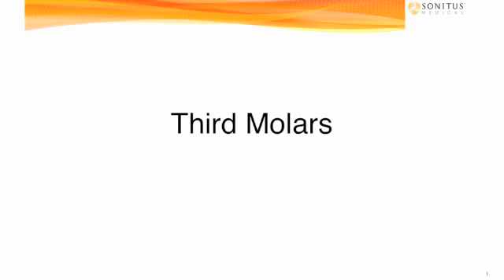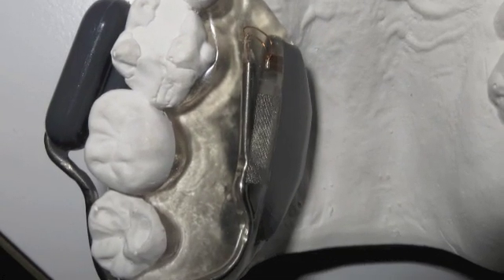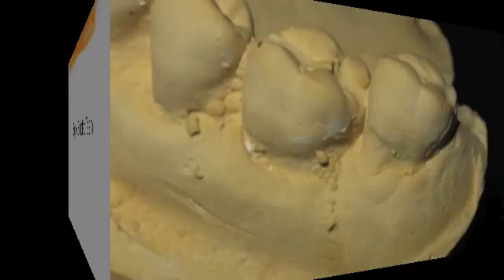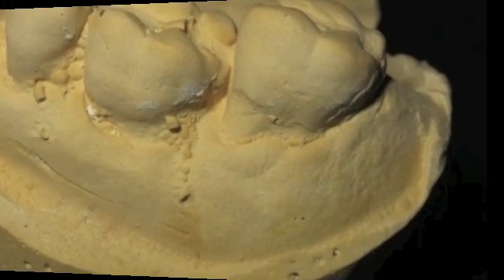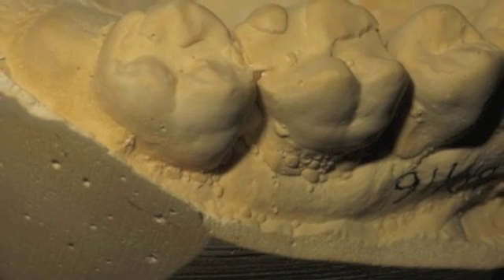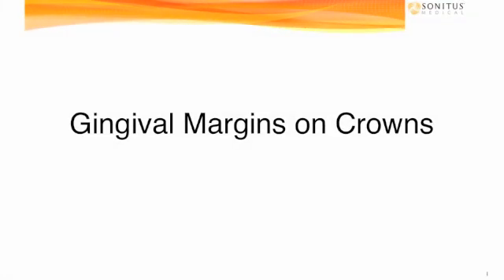Third molars don't seem to be an issue for SoundBite. We can work around those depending on if they're fully erupted and in good alignment. So third molars in good alignment, fully erupted, are great. Super erupted teeth are a challenge in that, like we said earlier, you want the actuator to touch two teeth in the exact spot. And here there's really no way of defining where that place will be. Choosing the opposite side is a solution for a super erupted tooth. Look for the side without a problem.